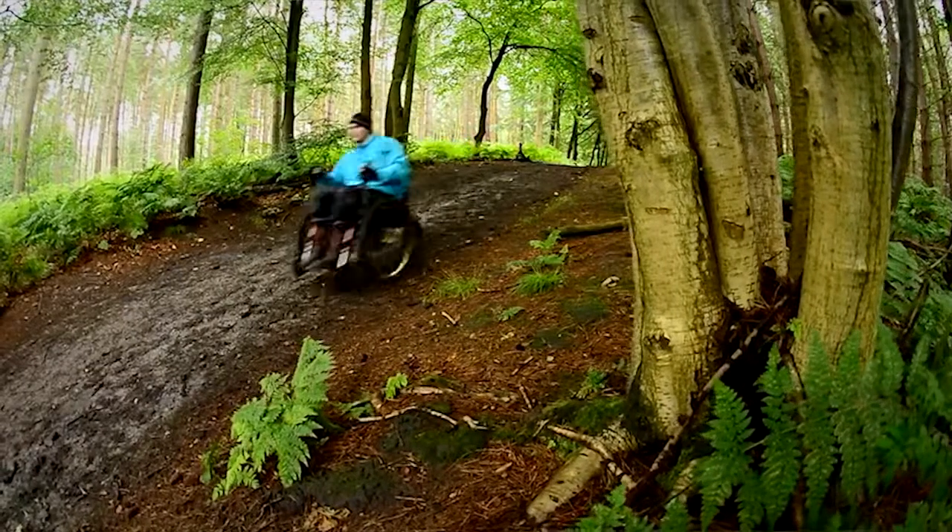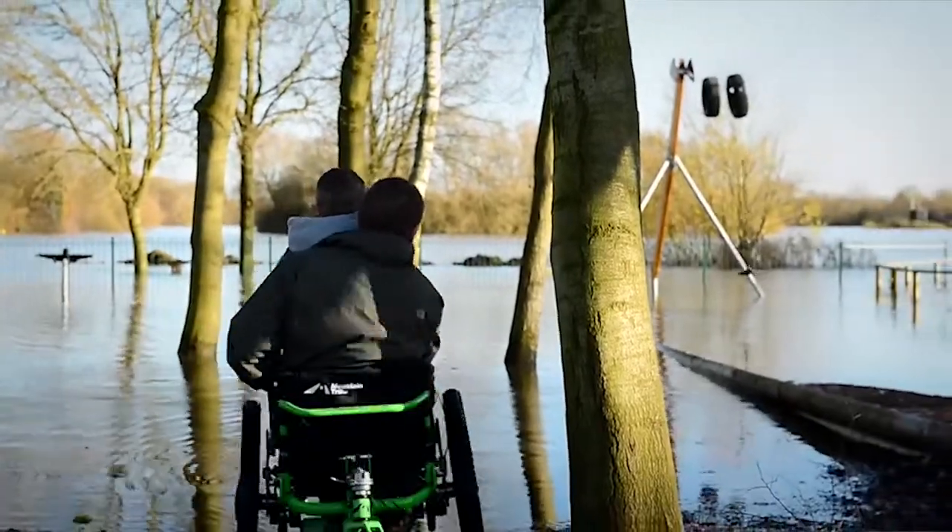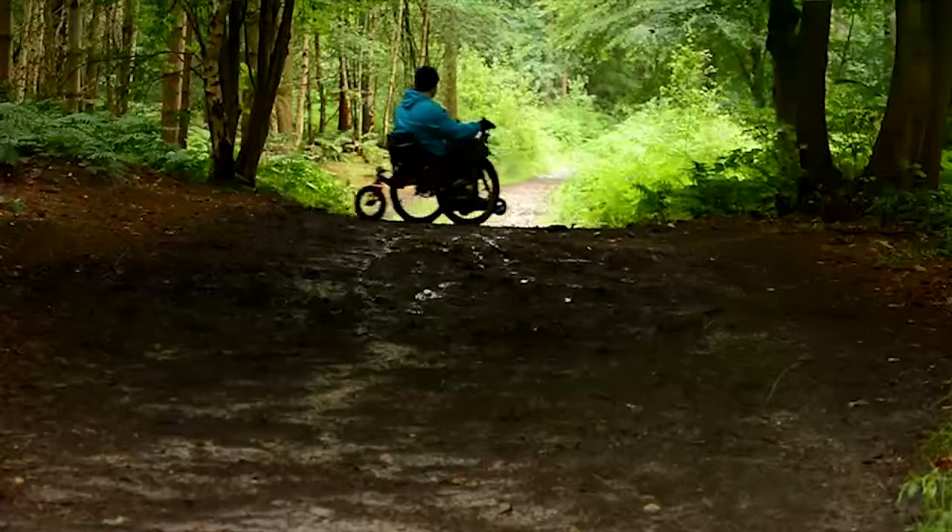What we strive for above and beyond everything else in our applications is quality. The future for the mountain terrain wheelchair is looking really exciting, and getting a really good working partnership with someone like Steba has really helped us — it has proved very successful.